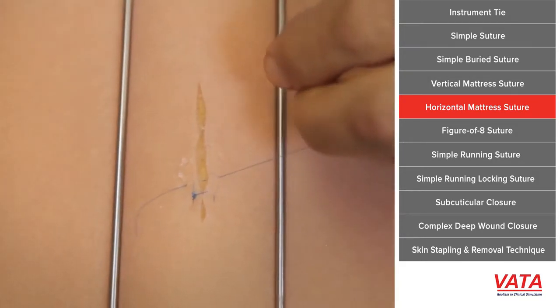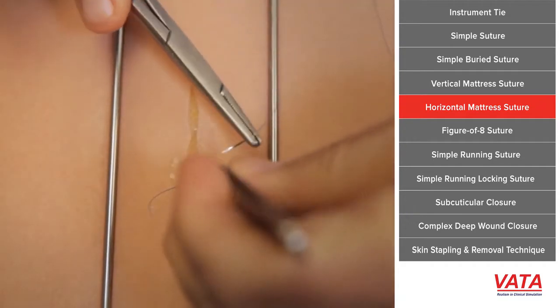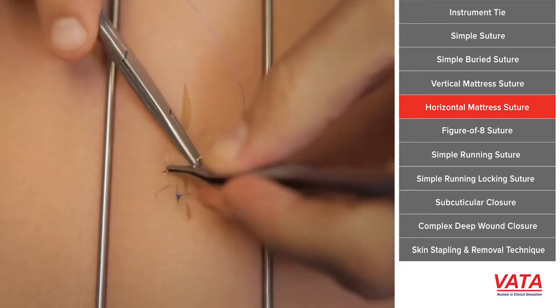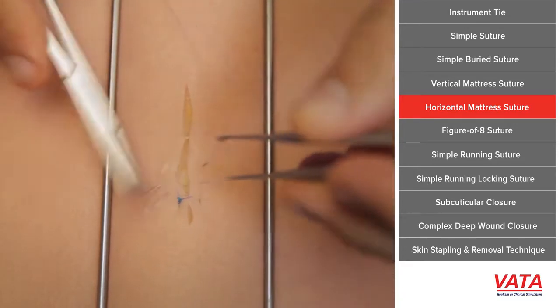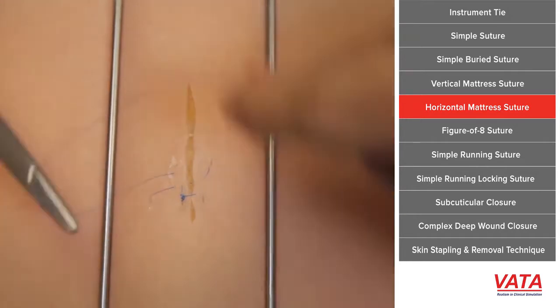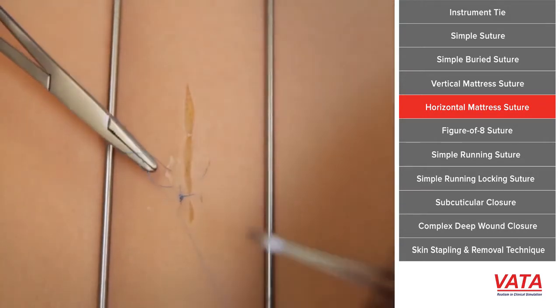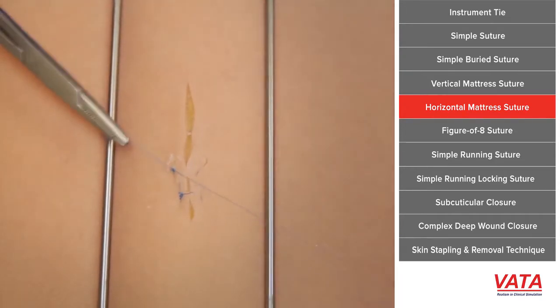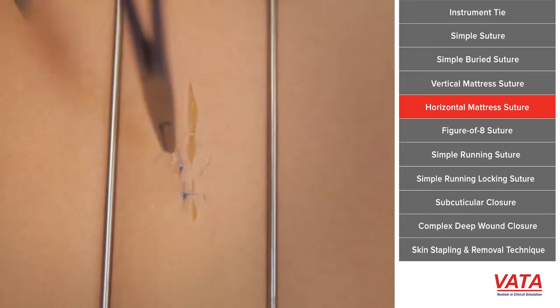Sometimes in cosmetic surgery we don't want any suture marks on one side. When you come to the second side, what you would do is take the first half of your simple suture and then simply take a dermal bite on the opposite side, then come back through the skin again. When you tie it down it will simply pull the dermis toward it. We often do that in cosmetic surgery in areas of hair bearing. This is good again for tension and good when the skin doesn't need eversion.